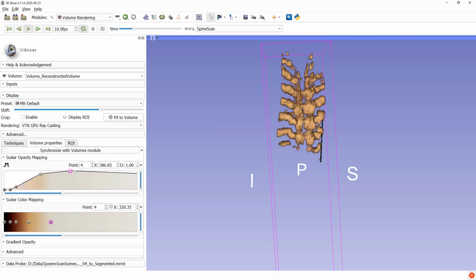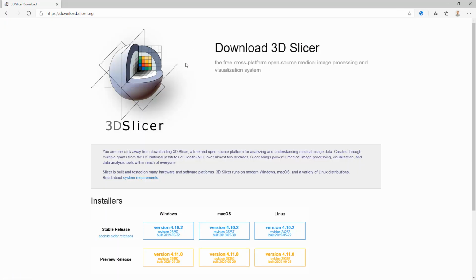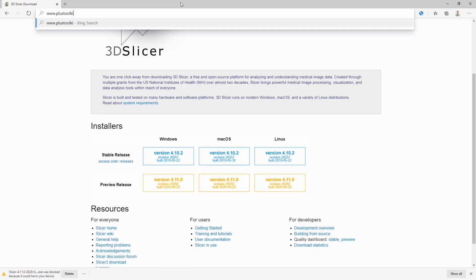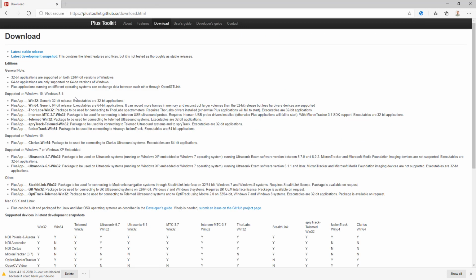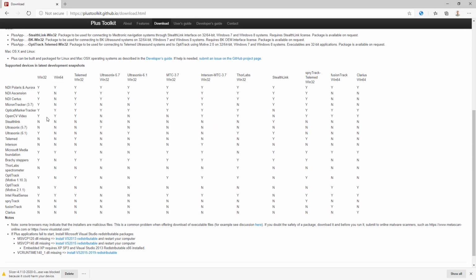Hello everyone, what we are going to be looking at today is how to reconstruct a segmented spine in 3D Slicer. 3D Slicer is one of the most popular open source medical imaging applications. We need to download the recent version, and also we will need the Plus Toolkit, which is another software that communicates with hardware devices and sends the data in real time to 3D Slicer.